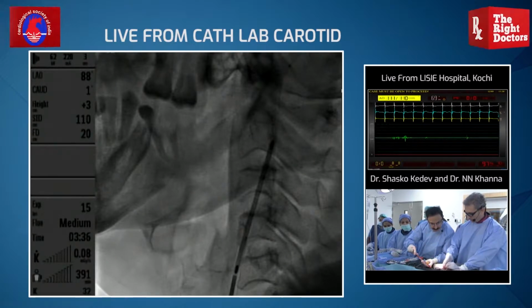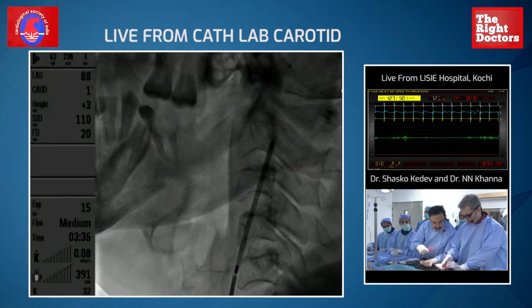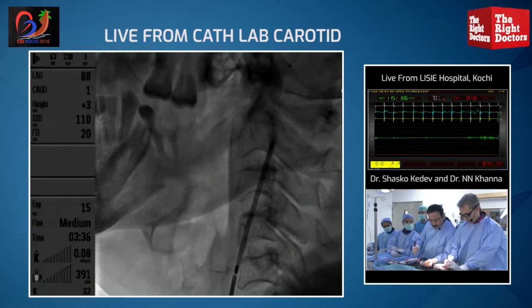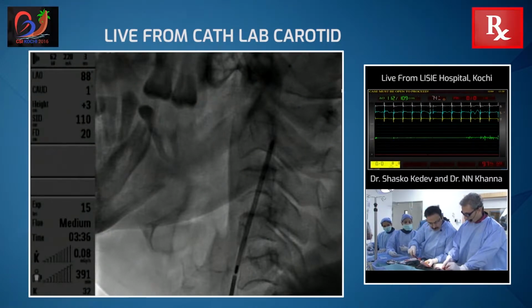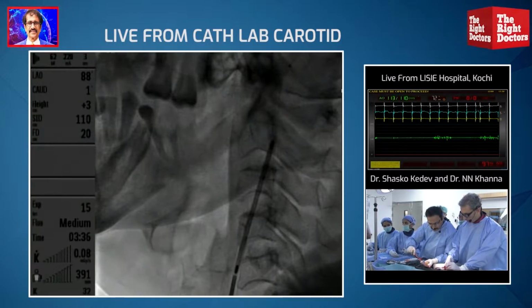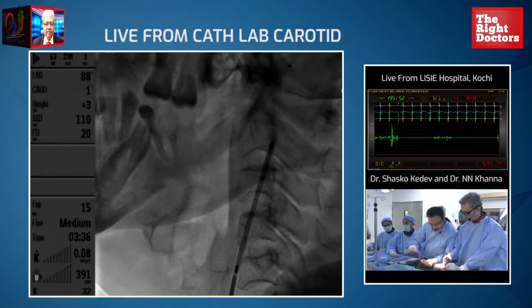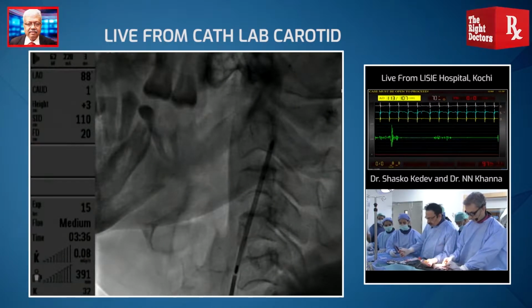Are you closed? Yes. I think this has some air. Yeah, because it's open here. No, please close it now. I'm opening, yes. Closed? Yes. Let me now aspirate a little bit. Okay, there is a lot of air. Allow it to clear the air.